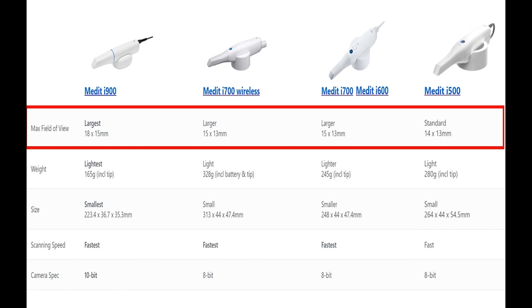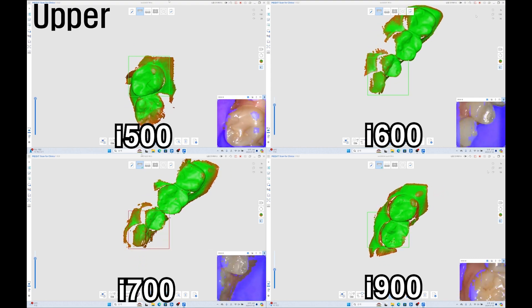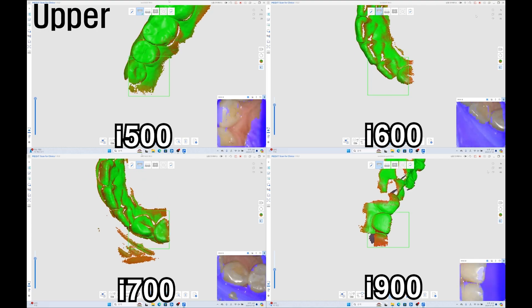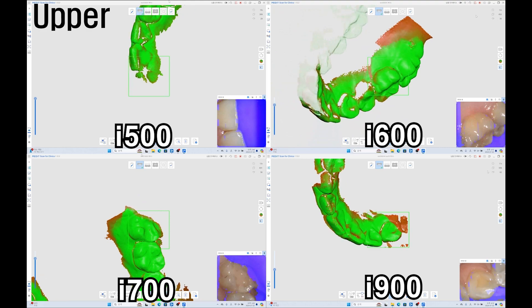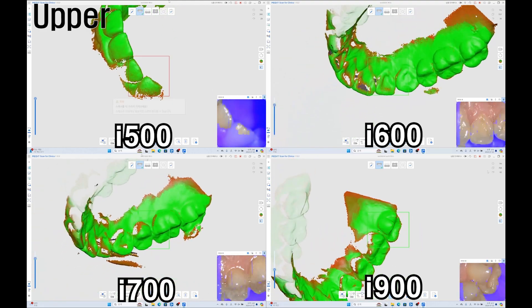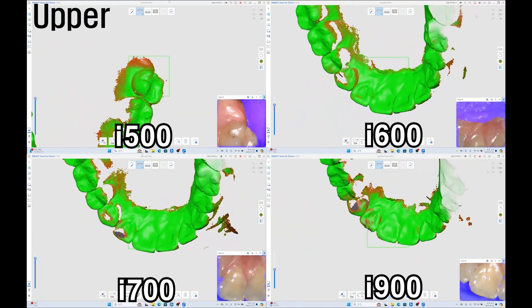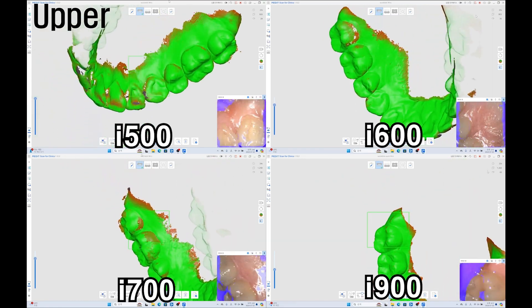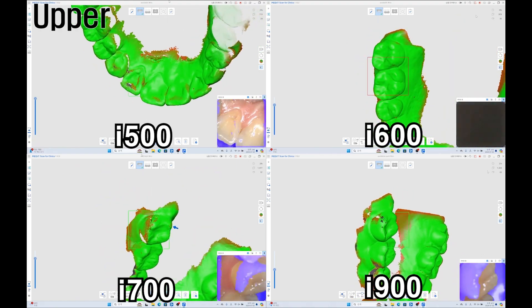Theoretically, this should reduce the time it takes to scan the same area. In practice, what surprised us in our tests was that the I-500 scanning speed was quite competitive. Scanning speed is influenced by the algorithm that stitches images together and removes peripheral noise, as well as the performance of the computer. Although the scanner hardware remains the same, software updates and improved computer performance have allowed for seamless scanning.